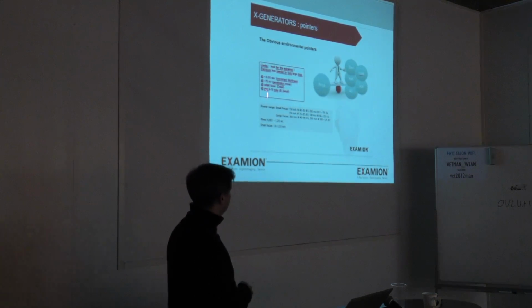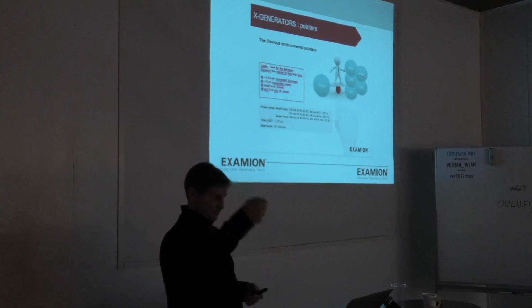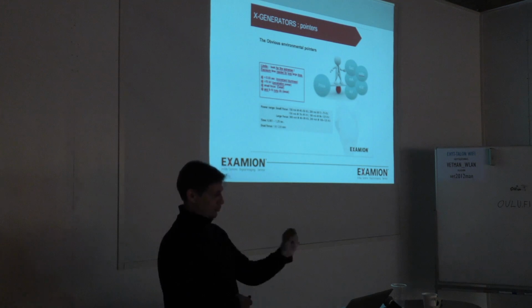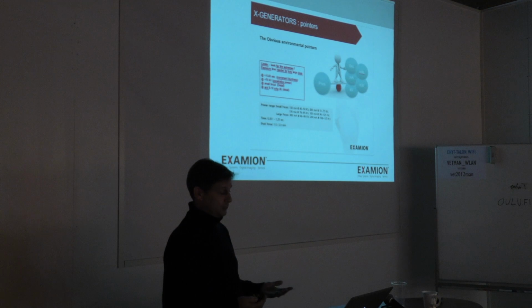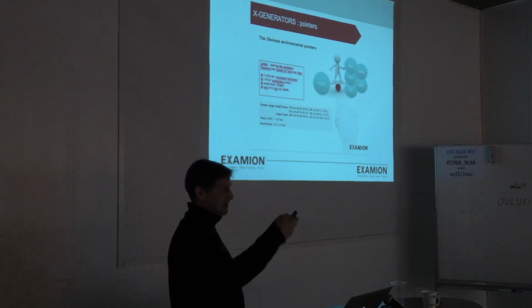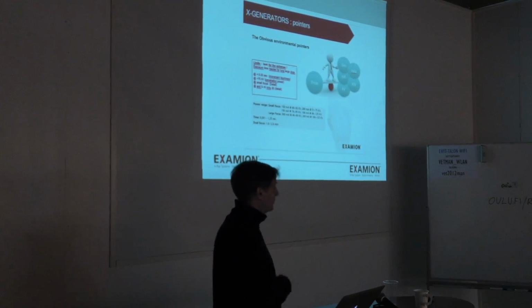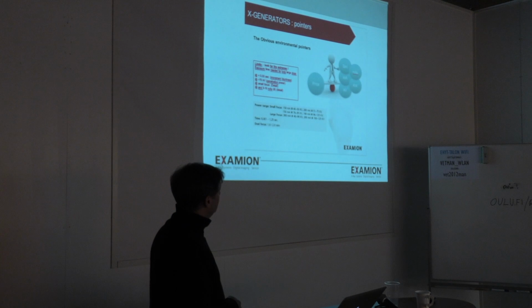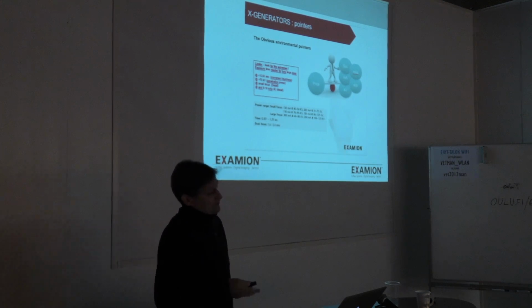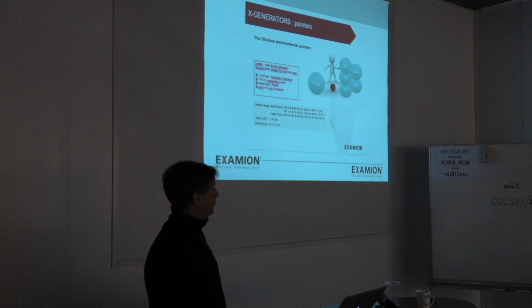Okay? So that's why they sometimes use a larger focus, where, like with a loupe on the sun, instead of burning the paper, you put a larger focus and it's not so sharp anymore, it doesn't become so hot anymore, so the machine is actually protected. Just like you wouldn't be able, with sunlight and a little lens, to put paper on fire when it's not focused sharp enough on the paper. And that's why some machines jump very easily and very fast to a large focus, but that diminishes your resolution and detail of your X-ray, which of course you do not want.